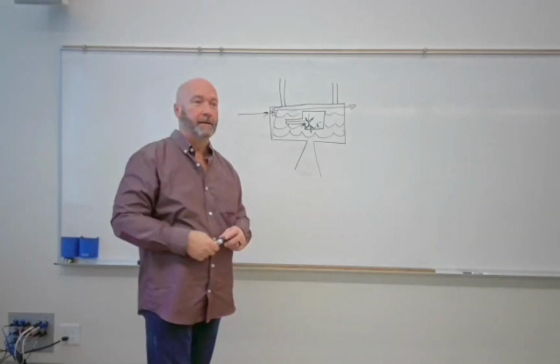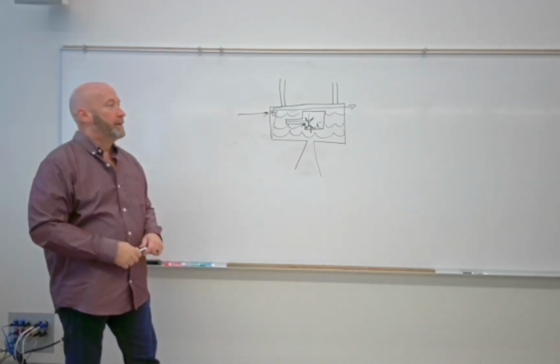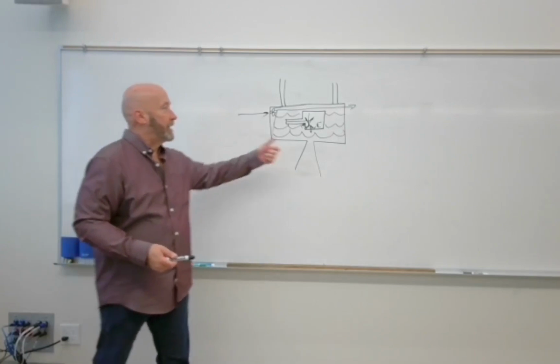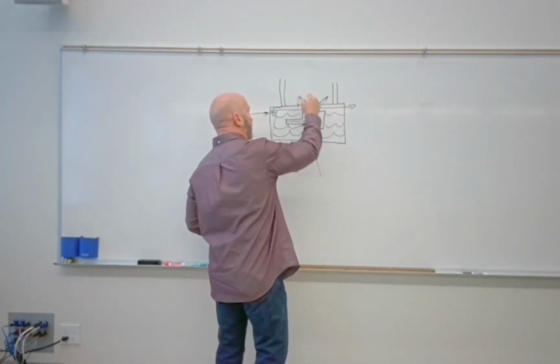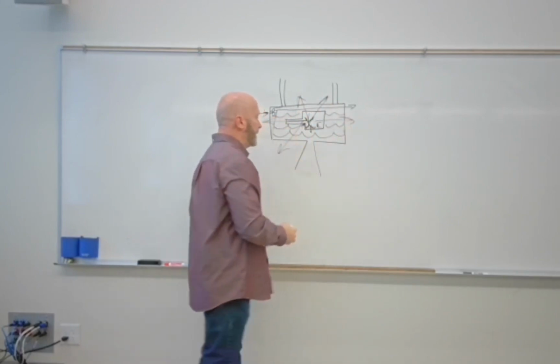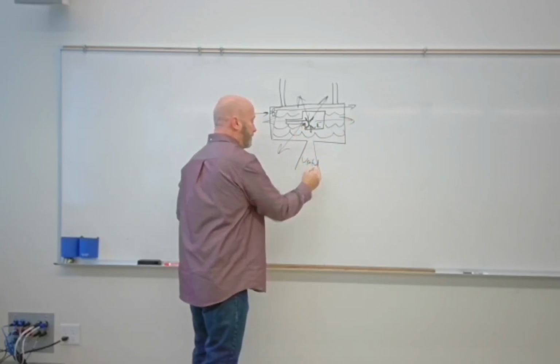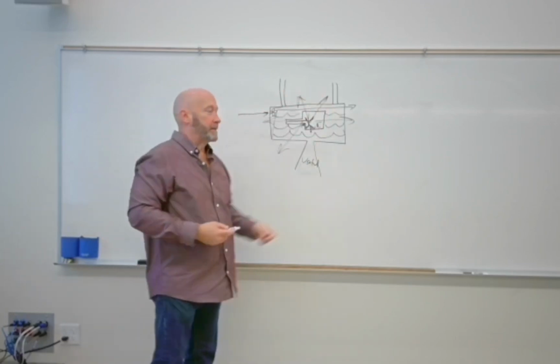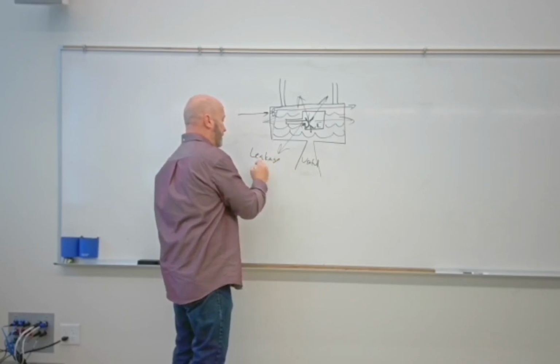No, because visible light just doesn't go through solid matter very well. So X-rays with that isotropic emission are going to try to go through pretty much everything in every possible direction. We want to limit it to the useful beam, but some may get out somewhere else, and that's what we refer to as leakage radiation.